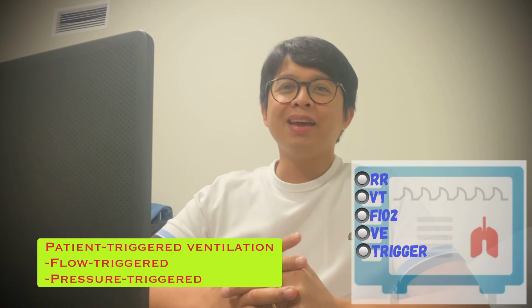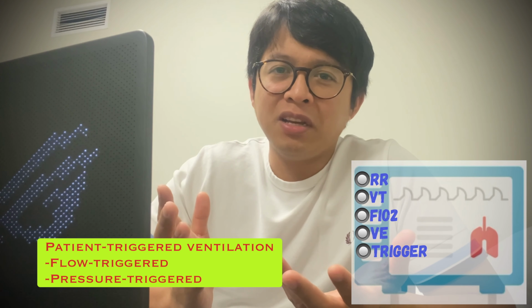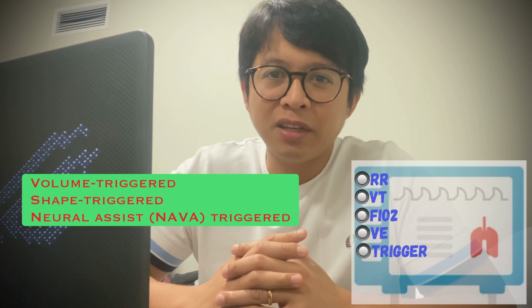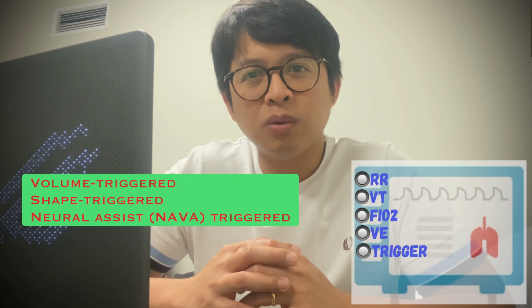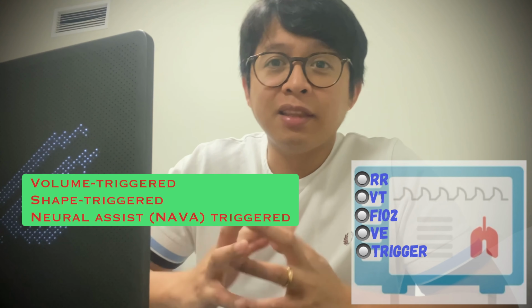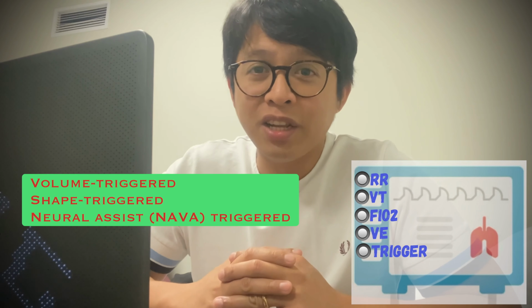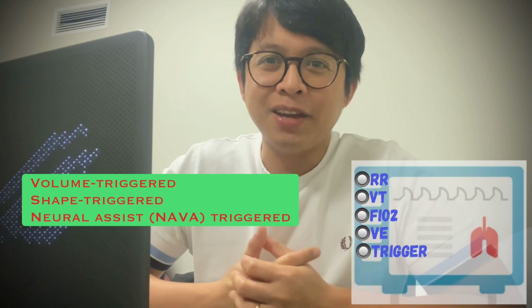In addition to that, there are other triggered ventilation modes, like shape signal triggering, and then what is the other one? I forgot. Yeah, the neural assist, or NAVA, triggering. Okay, still with me? Okay.